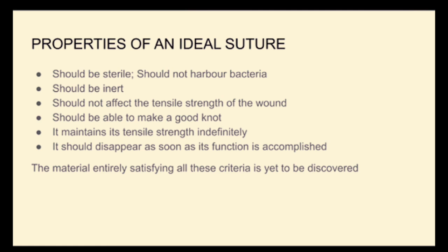It should be able to make a good knot. It should maintain its tensile strength indefinitely, and it should disappear as soon as its function is accomplished. However, it's worthy of note that a material that entirely satisfies all these properties is yet to be discovered.